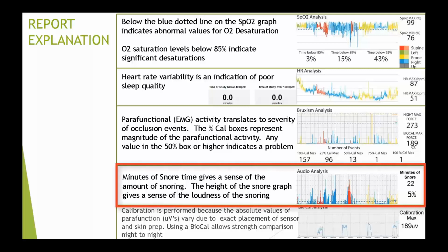I will tell you, there's 2 reasons for intermittent snoring. Patient snores is positional, meaning they snore on their back and they don't snore on their side. That's not the case here. Or the patient is awake, and that's why they're not snoring. So those are the 2 reasons why a heavy snorer isn't snoring.